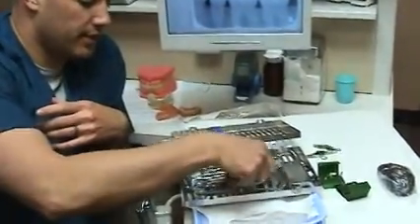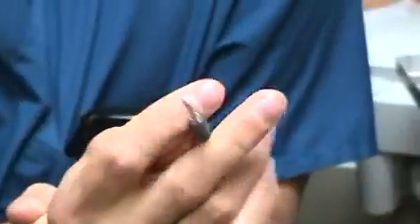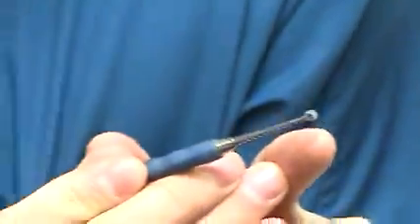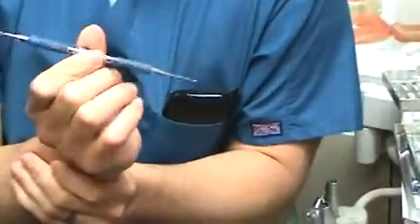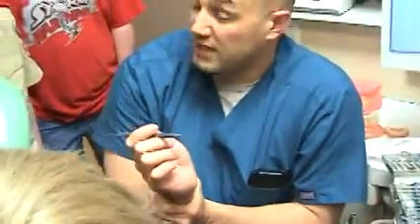This instrument here is called a ball burnisher. What we use this for, we can see it's got one end down here that's kind of big and round, and then another end that's pointy. And then this end right here is kind of round.